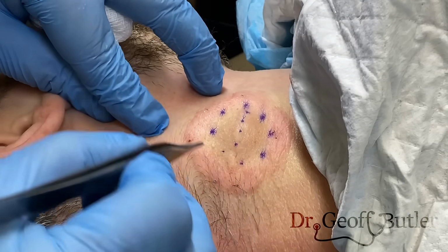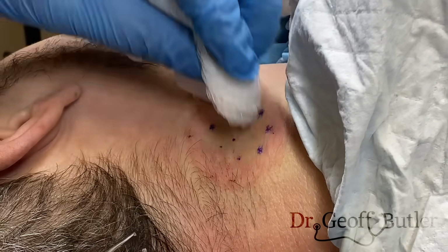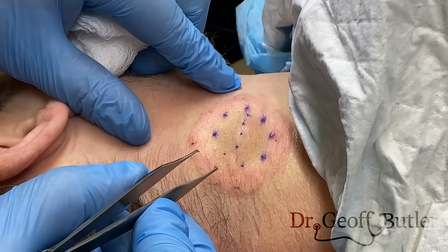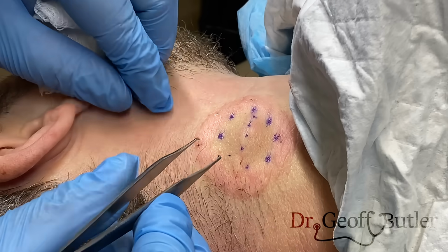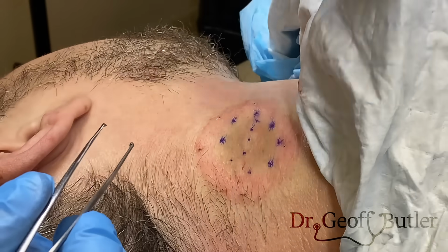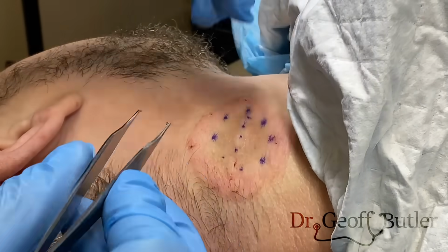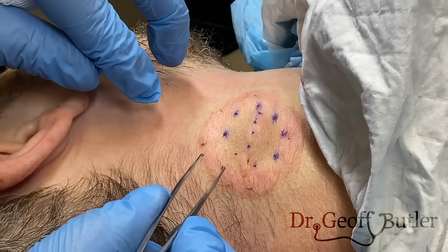you a little bit. So when you're seeing these videos, you might think that the scalpel is either blunt or dull, and that's not the case. It's just because the skin type is hard to work with. And so teasing it back through will take us more time. Similarly, because you have the shoulder here, almost like a mountain guarding the neck, it's hard to work within this space. So from a physical perspective, that can be a little bit challenging.